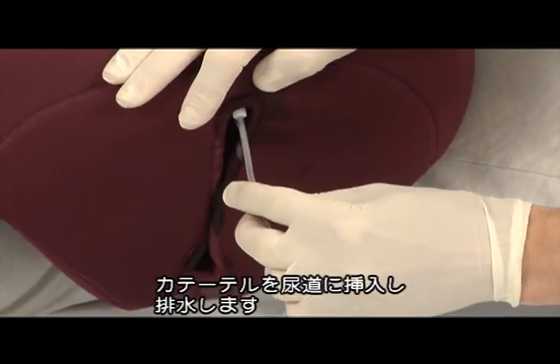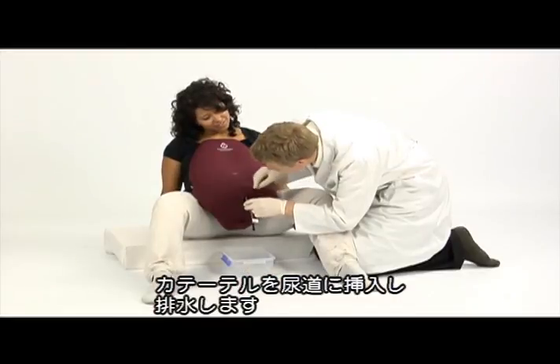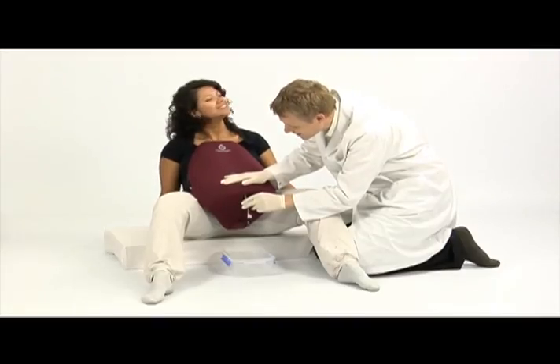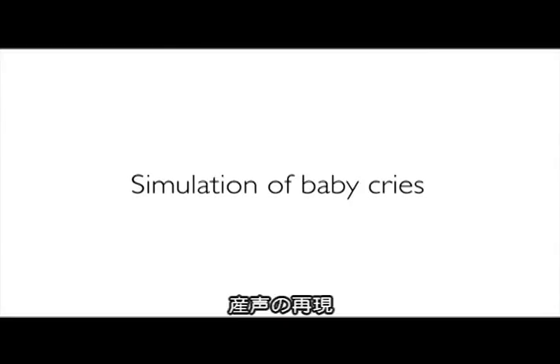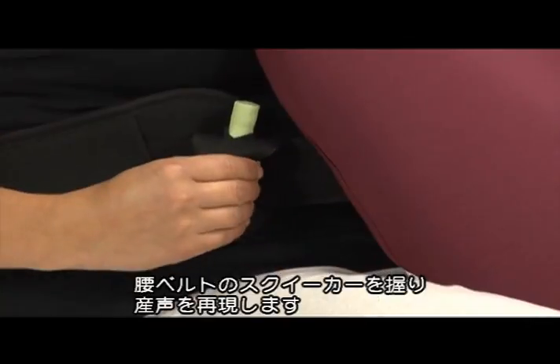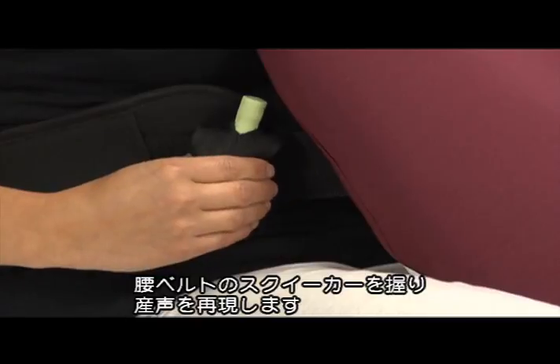Insert the urine catheter through the urethra until the bladder is empty. Gently press the squeaker unit located in the waist belt to emit the sound of a crying baby.